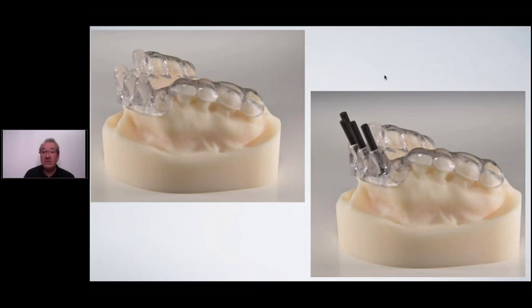Naturally, we print a lot of these things here, like you see here, for placing your implants. We don't call it an implant drilling guide, but a positioning guide. It is basically that the dentist knows where we would like to have the implant positioned. So we set up the teeth, and then we print where the teeth were the holes. And so if the dentist now is free, he can take a pilot burr, make a small hole, and he knows where we want to have the implant. He decides what kind of angulation he needs because of the bone situation.